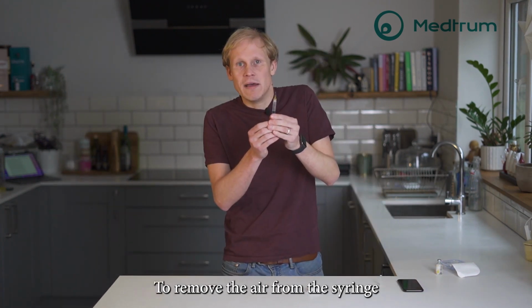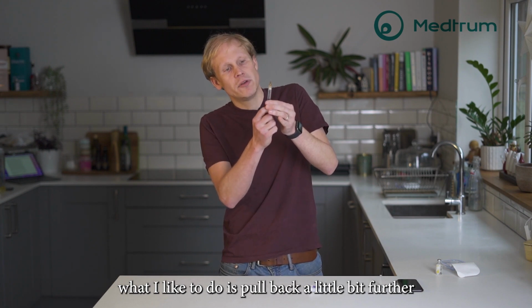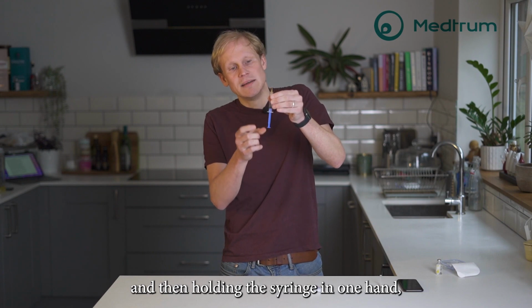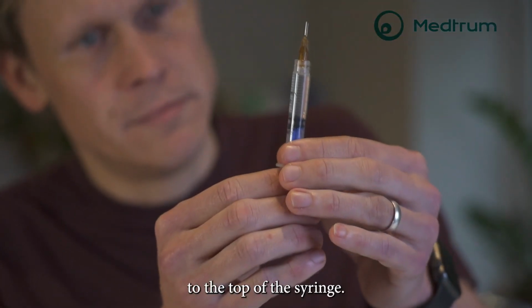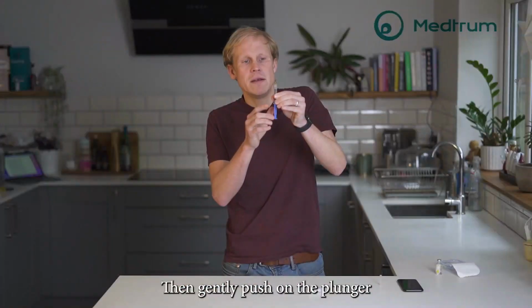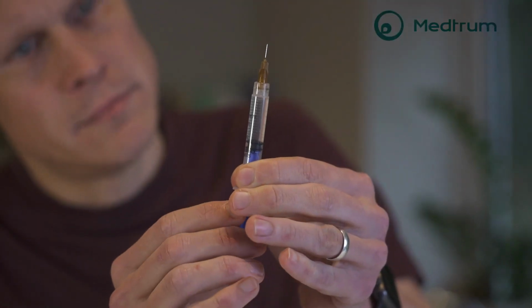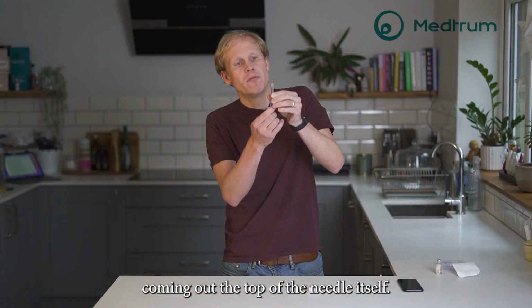To remove the air from the syringe, what I like to do is pull back a little bit further on the plunger, and then holding the syringe in one hand, give it a good flick to get all those air bubbles to the top of the syringe. Then gently push on the plunger until you get a few drops of insulin coming out the top of the needle itself.